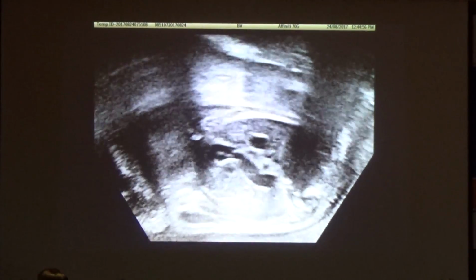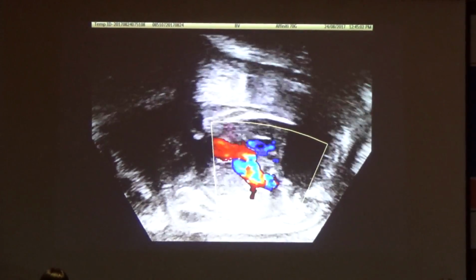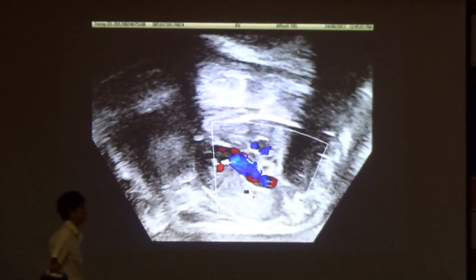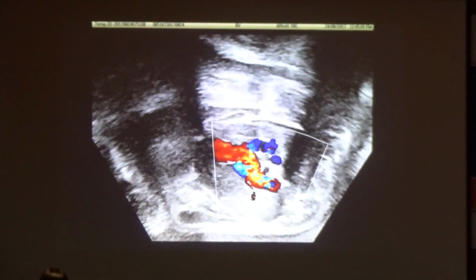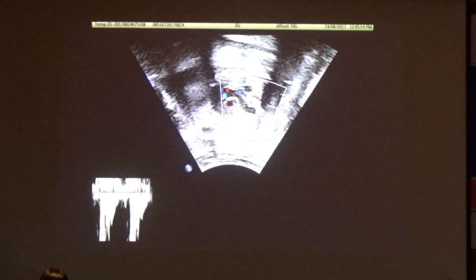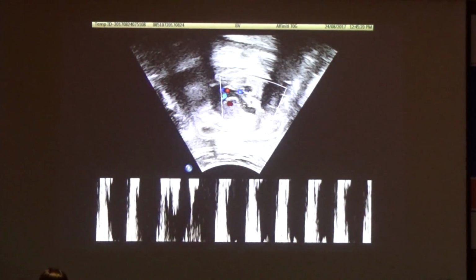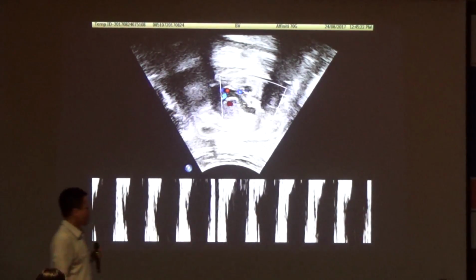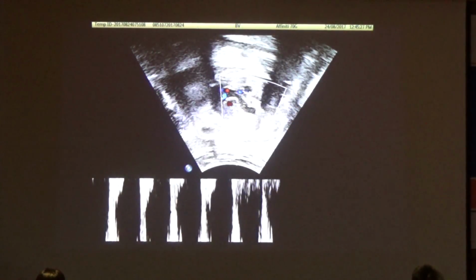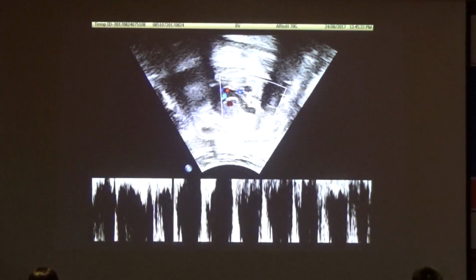There's the duct right there. Look at the size of that duct. Just put the pulse Doppler in there, right in there. No, not there. Higher and in there. That's good. Okay. Now, how do you adjust the baseline? I don't see left to right shunting there. Okay, so to my mind, this is a big giant ductus. It's unlikely that there's going to be a problem.